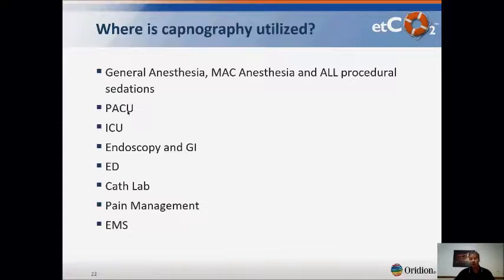They also use CO2 monitoring in the PACU. This is probably the biggest growth area. So when you go into an anesthesia department or an operating room, you want to ask, are you monitoring capnography in the PACU? And if they say no, you might say, are you interested in doing that? Because we can provide them monitors, and we also sell monitors, so that might be an opportunity for you. In the ICU, they're using capnography primarily for ventilated patients. Sometimes they use it continuously. Sometimes the respiratory therapist will come in and spot check their CO2 readings. Sometimes the CO2 capability is built into the ventilator.